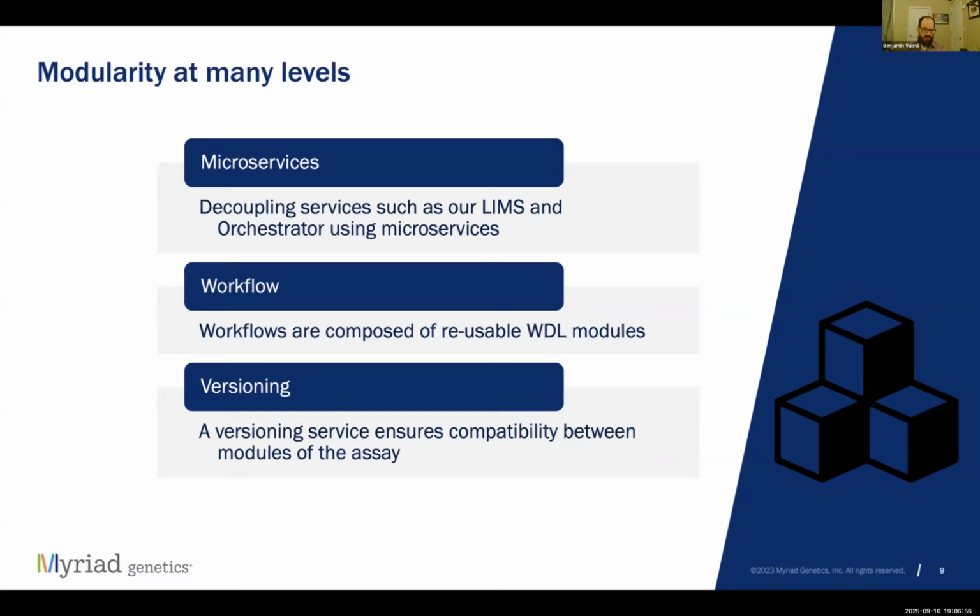Workflows are composed of reusable WDL modules. When workflows were in development, it was common to copy and paste between repository sections of a workflow. However, in production, this system has been replaced with published artifacts that can be referenced in a master workflow.